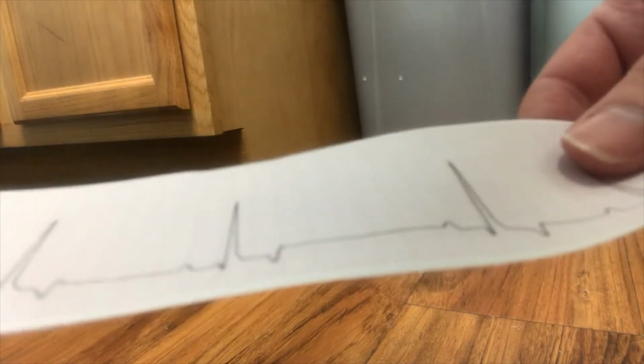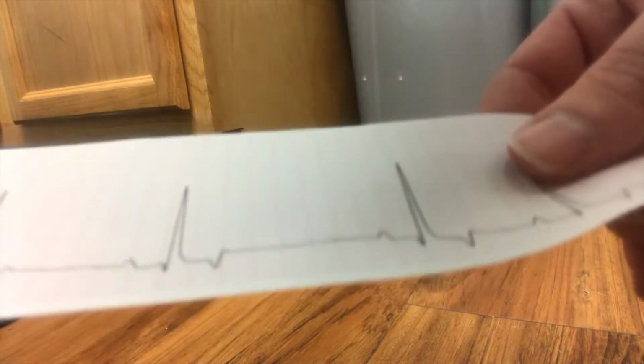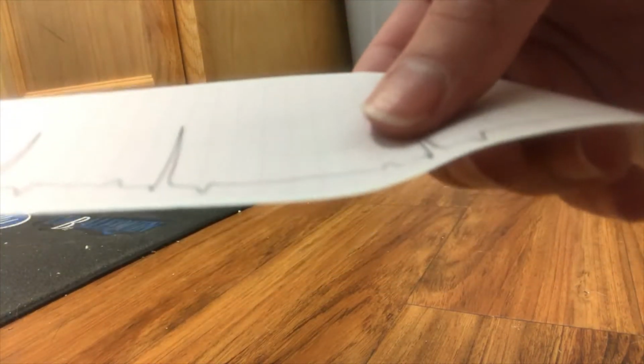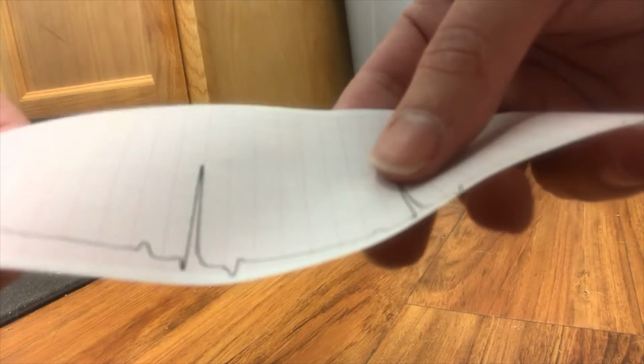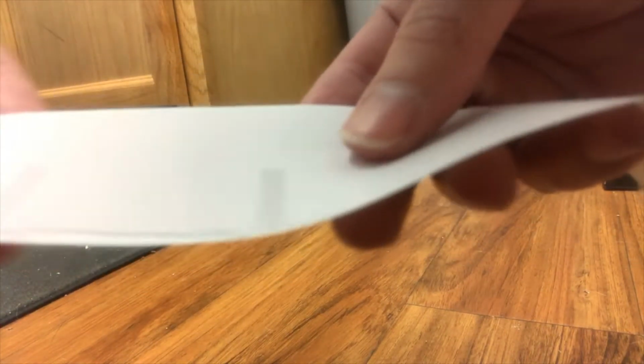There is some gaps between each of the QRS complexes and the P waves and the T waves, like through here, that could indicate something such as a sinus arrhythmia where the heartbeat rests for a second in conjunction with the respiratory rate. You can see that there is a P wave for every QRS complex and vice versa. You can notice that the T waves are all looking even.